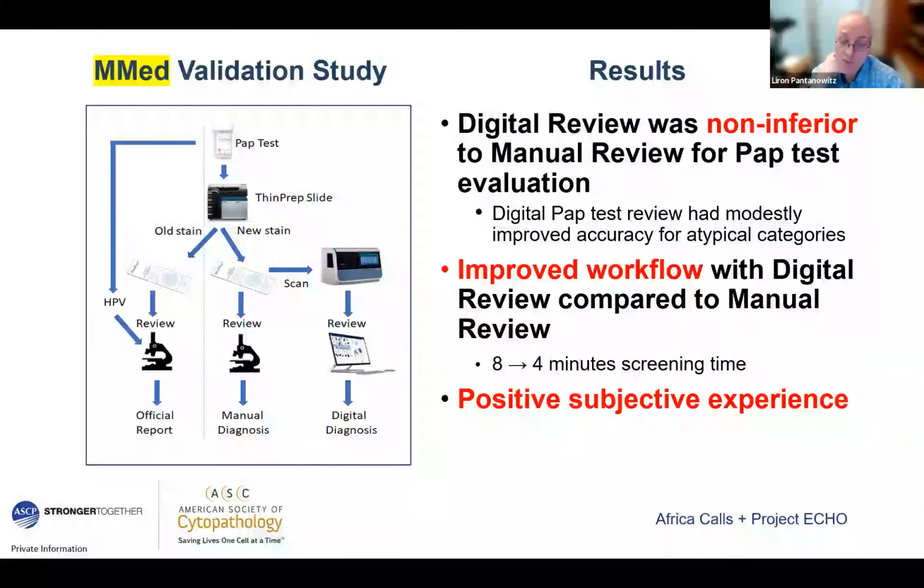And when we asked people how they felt, which included 6 cytotechnologists and 3 pathologists who did this validation study, all of them subjectively said that they liked this and would use it every day. Plus, they are no longer tethered to their microscope. So now they can work anywhere. They don't have to be stuck to a desk in an office at a microscope. They could be rotating anywhere or even work from home if necessary.